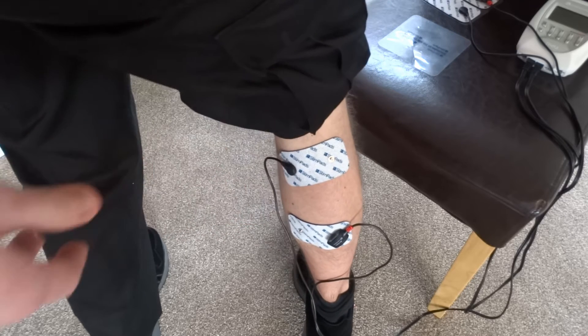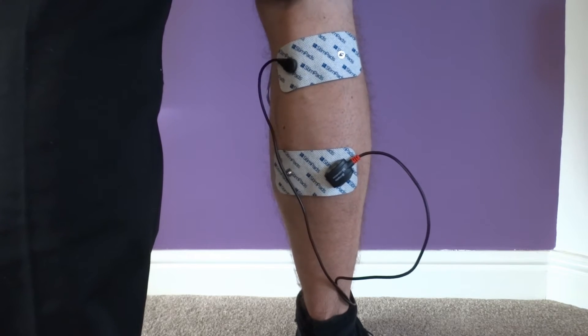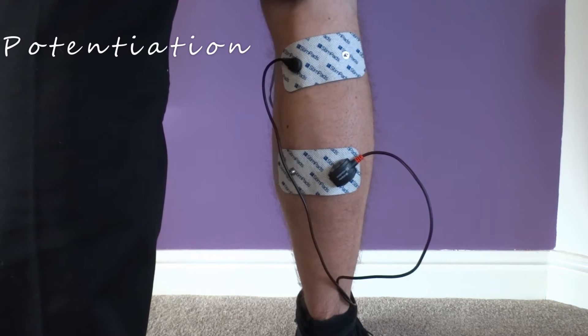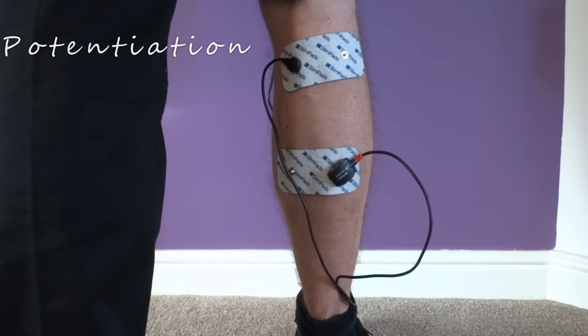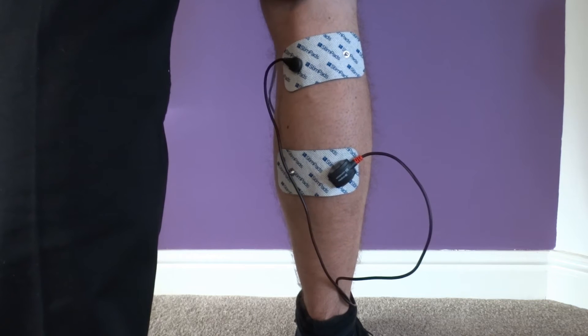Now you have choices as to what to do next. Ideally start with potentiation, which is 3 minutes long, and the aim is to take the intensity up as high as tolerably possible. This will essentially warm up the muscle and nervous system ready for the workout. If somebody is very weak and chronically inhibited in this muscle, use the potentiation, then use a low frequency setting such as endurance, which activates type 1 muscle fibres.